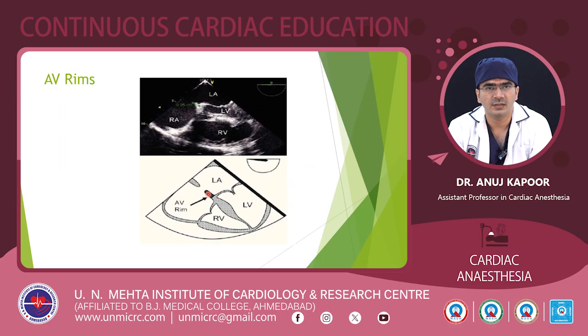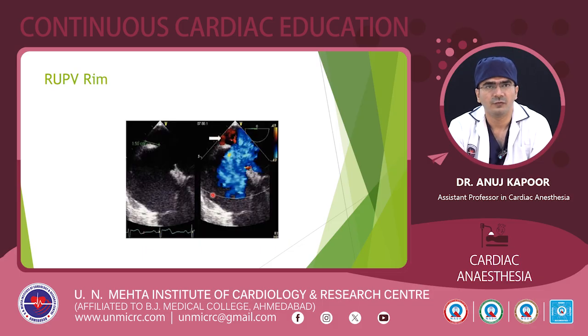Secondly, in the same view, we will get the AV rim also. The AV rim is also nomenclatured as the mitral rim because it is formed from and supported by the AV walls. So this rim can also be seen in a 4-chamber view and can be measured. Going forwards, we will do the RUPV rim. The RUPV rim is typically seen in a mid-esophageal view, but we'll have to slightly pull the TEE probe out, and slight rightward rotation is required to see the RUPV rim. And we'll have to measure the length of the RUPV rim.